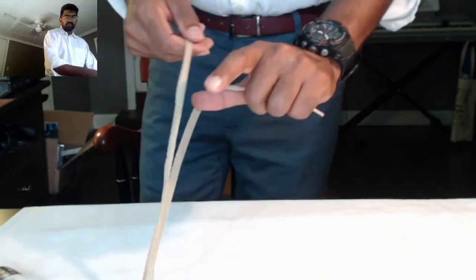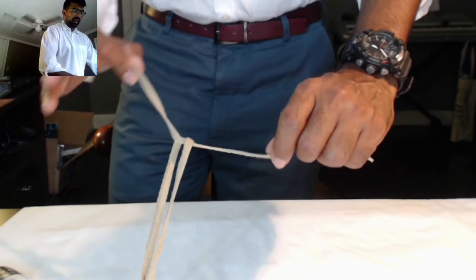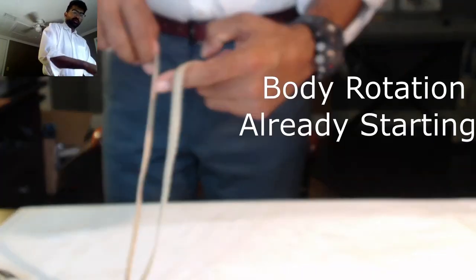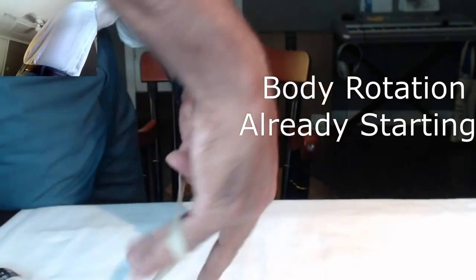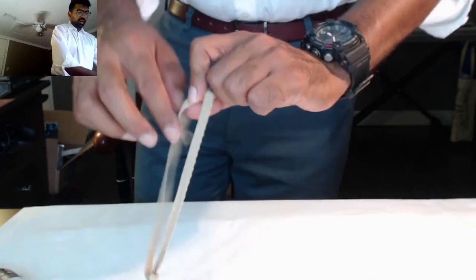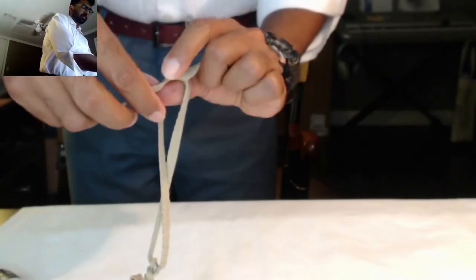Now, coming back, I'm ready for... And again, this is going down flat. So same thing. Down. I know I'm going to throw a shooter. Body's already turning. The sweep happens. Knot goes down. So in this fashion, I'm not rushing anything. You notice that each of my knots are coming down square. And I'm making a slight turn in my body to make sure that these knots go down.